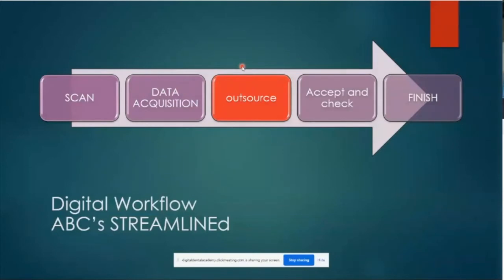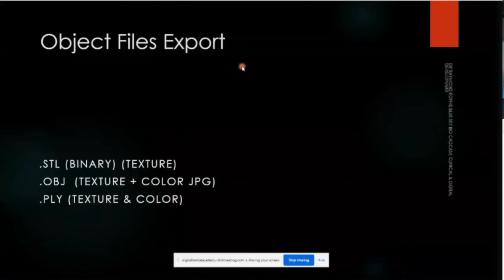So good. Then, how does the outsourcing work? You send all your models, they design it, and then after they design it, you just accept everything, all the treatment plannings, check that everything is okay, and just receive the finished part. And that's it. Okay.